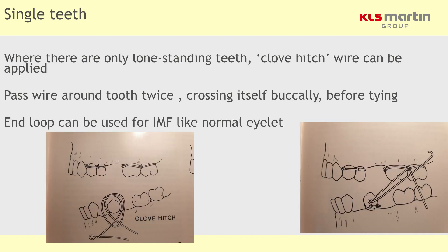As far as single teeth are concerned, the clove hitch wire is used here, and that's quite a difficult thing to do. I would tend to go for an arch bar in this situation.